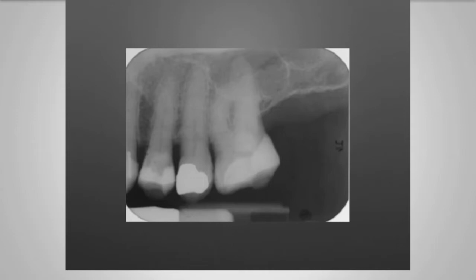Well, the canal is very fine, you could block the canal, you could certainly ledge at the point where there's a sudden curvature, or you could even separate an instrument in a really tight curved canal like this. So in a case like this, to manage a curve like that, you need to make sure that you've definitely got a reproducible patent glide path before you use any rotary instrument.